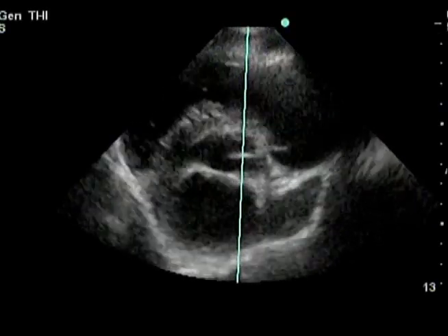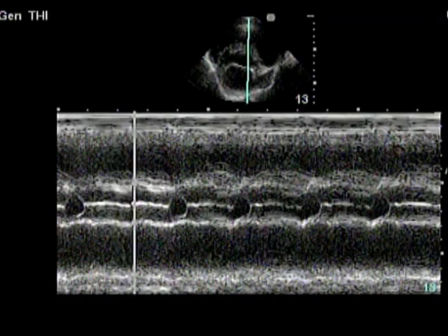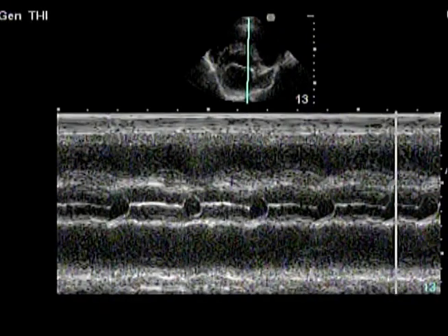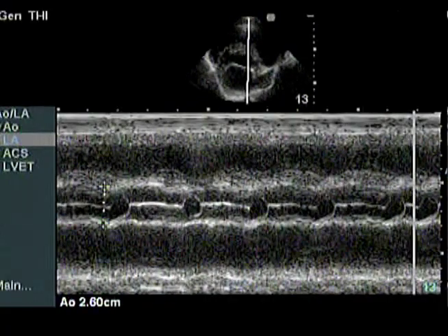A ratio of left atrial to aortic diameter exceeding normal limits indicates left atrial enlargement. This ratio is most useful when subjective visual estimate of left atrial enlargement is questionable. Left atrial size is used along with patient symptoms, blood pressure, and other cardiac ultrasound findings to determine the stage of mitral insufficiency and the timing and type of treatment to be given.